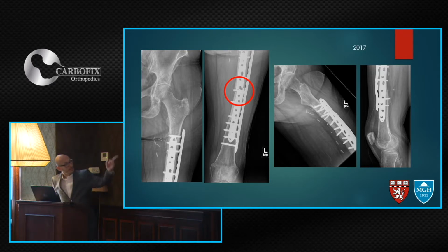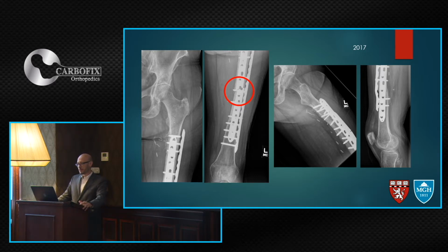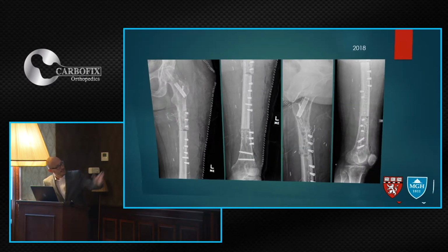Springfield did this. But the patient didn't follow the recommendations in terms of limiting her weight bearing. She didn't want surgery immediately. She needed to plan her agenda and be sure that the surgery will happen when it was convenient to her. And she came with the plate bent, and then this is what we did.